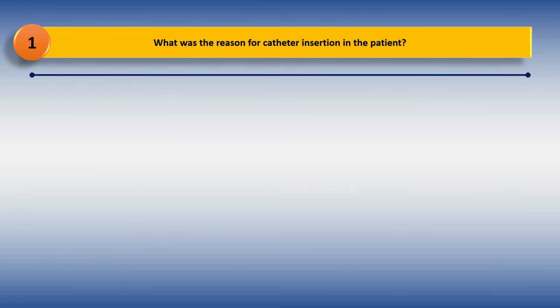Talking about the first area, you should seek the information from the patient directly, or his caregivers, or from his medical records. And if you do not have these from the records, do not hesitate in calling his doctor. There are many situations in clinical practice because of which the catheter is placed. And according to each situation, the timing of removal of the catheter or the precautions required at the time of removal are influenced. Let me explain this.